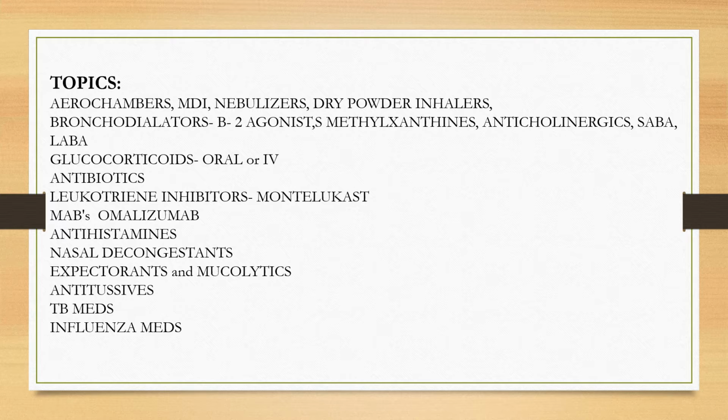Okay, a nebulizer is where we'll put liquid forms of medications such as albuterol or ipratropium into a nebulizer, and then we'll run oxygen through the nebulizer, and then with a face mask or some kind of mouth attachment, it'll be misted and they'll inhale the medication.